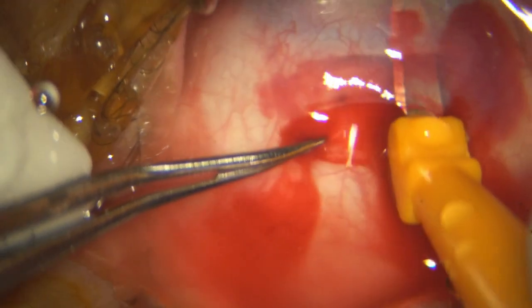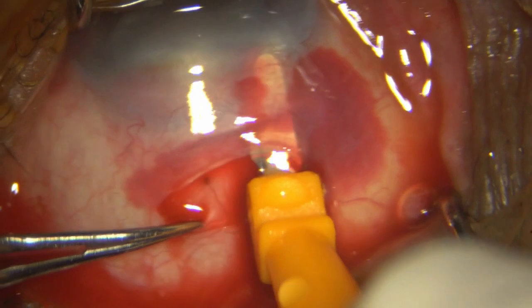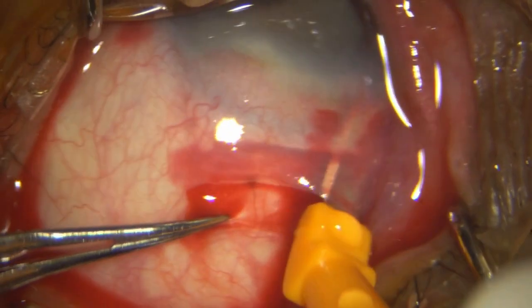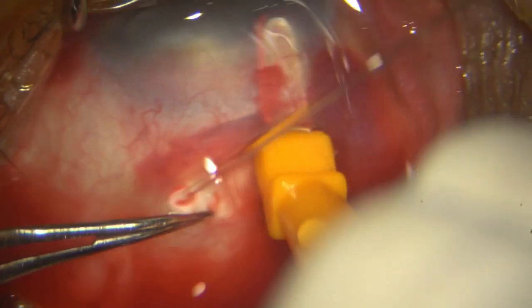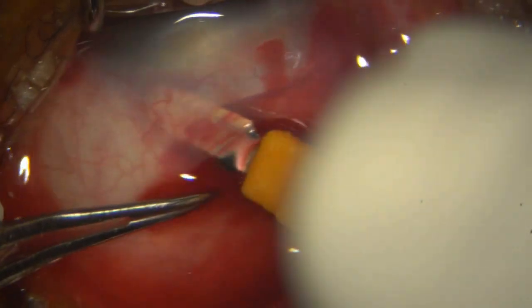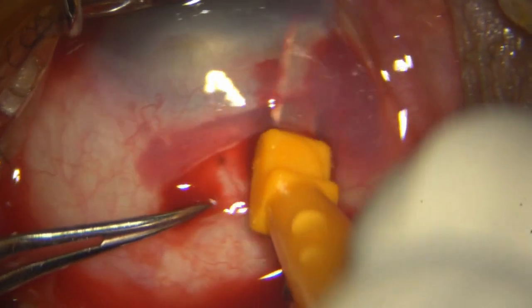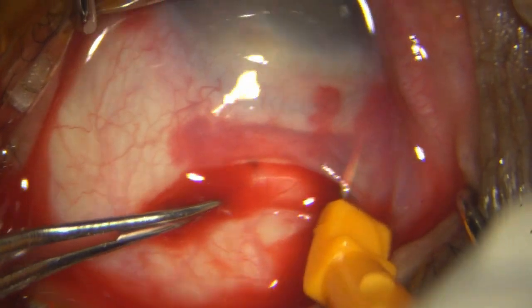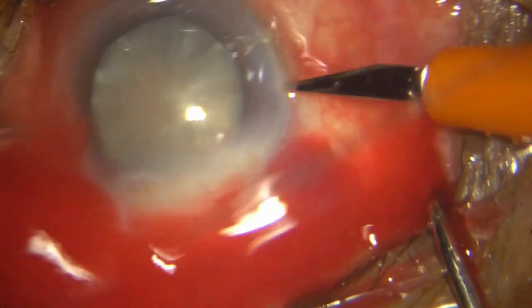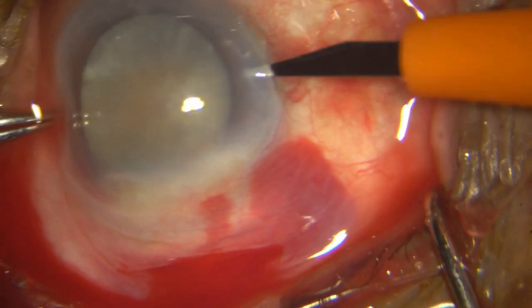She is very elderly. Block is not exactly great, so poor thing must be feeling some pain or discomfort at least. However, she is cooperating as much as possible. There will be the occasional downward movement of the head, can't help it. And look at that bleeding. But it doesn't bother my surgical field as such.